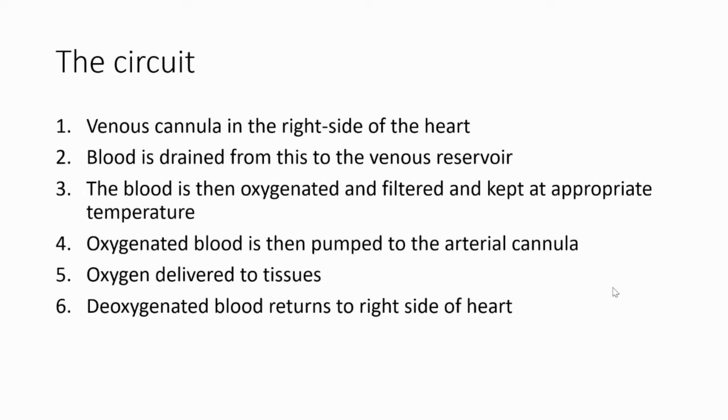And then the circuit starts again because once you pump the blood via the arterial cannula to the rest of the body, oxygenate the tissues, the blood is then deoxygenated, returns back to the right side of the heart, drained back via the venous cannula, and it starts again.